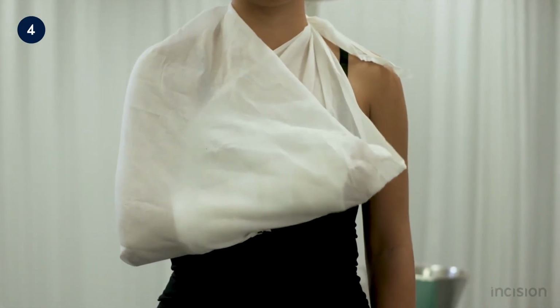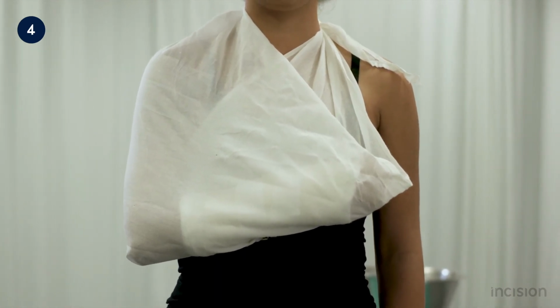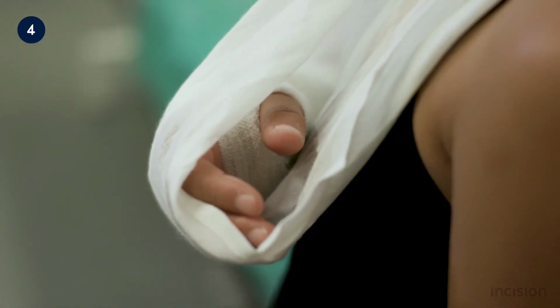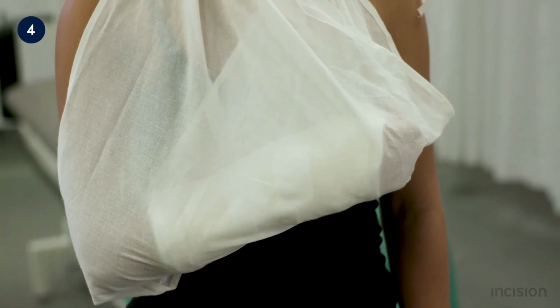Note that the hand is positioned higher than the elbow to prevent swelling of the forearm and hand. Be aware that a triangular bandage is preferred over a sling, as a sling carries the risk of causing pressure complications via indentations in the plaster.